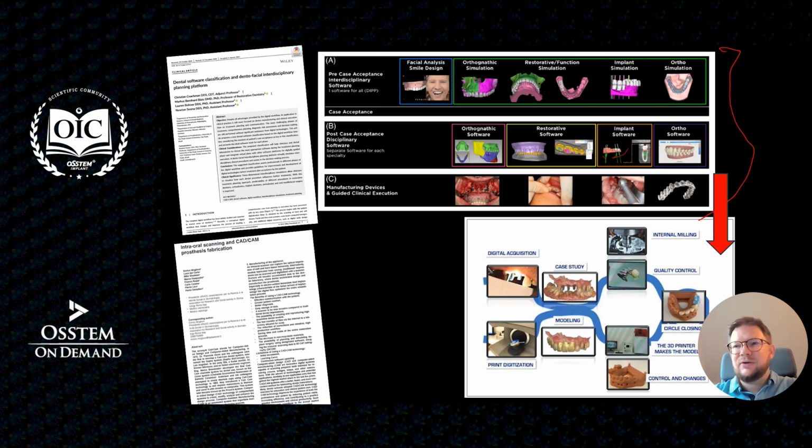And if we have it done and we get the patient's acceptance, after big help of that software and all the visualization, which can help us to explain to the patient what we are going to do, then we make the surgery. And after the implants are integrated, we check everything and we have a good healing. We then take another step.